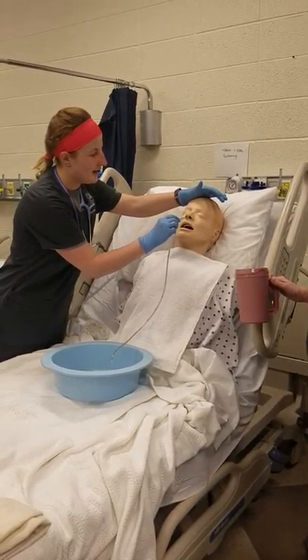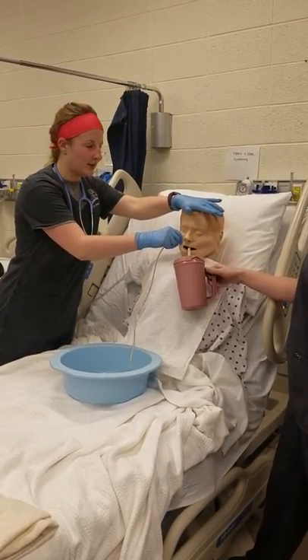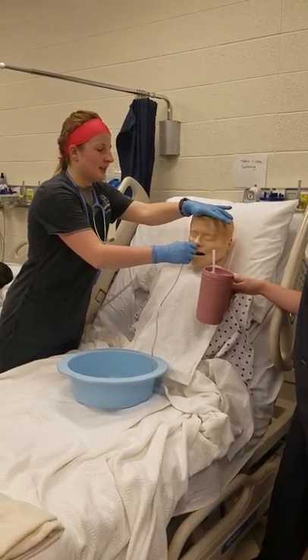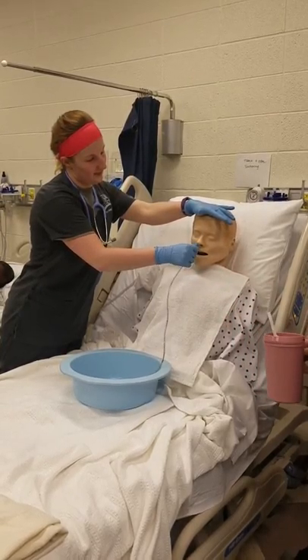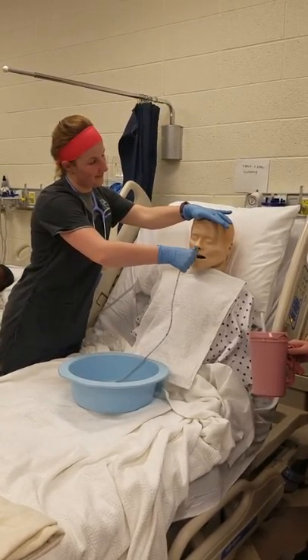I'm going to go ahead and insert. As soon as he starts to cough, I'm going to have him tilt forward and start taking a drink of water to help it pass. I'm going to continue on down until I meet resistance.